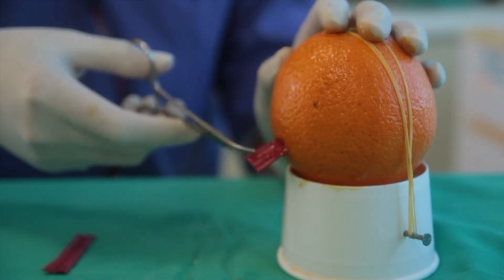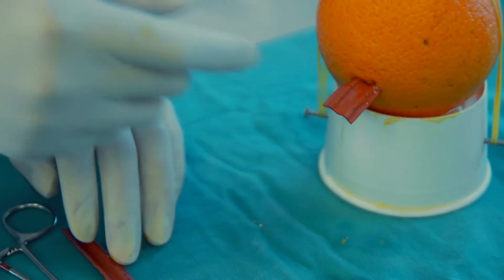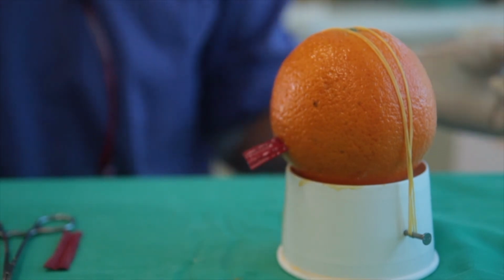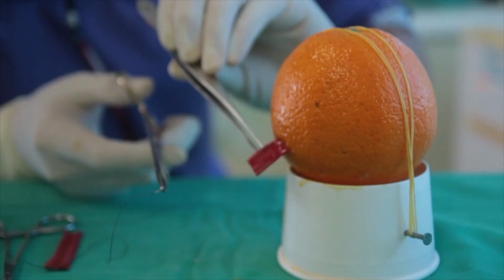This will make sure the remaining pus can come out from the side. To secure the drain, this is when we use the suture. You can secure the rubber drain to the skin by using the suture.